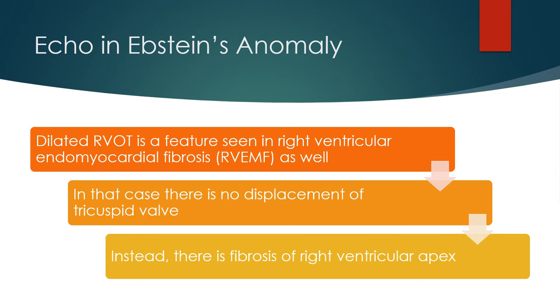Dilated RVOT is also a feature seen in right ventricular endomyocardial fibrosis. In that case, there is no displacement of the tricuspid valve; instead, there is fibrosis of the right ventricular apex.